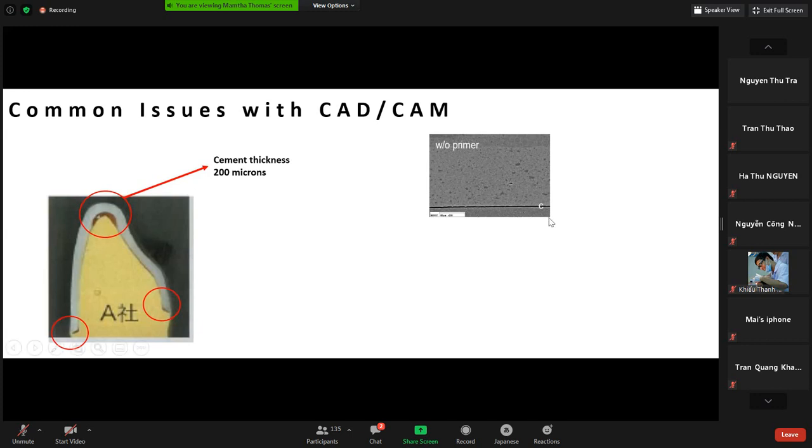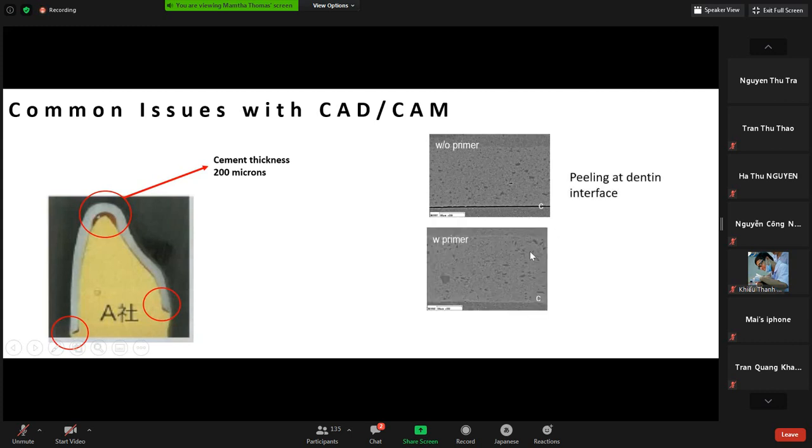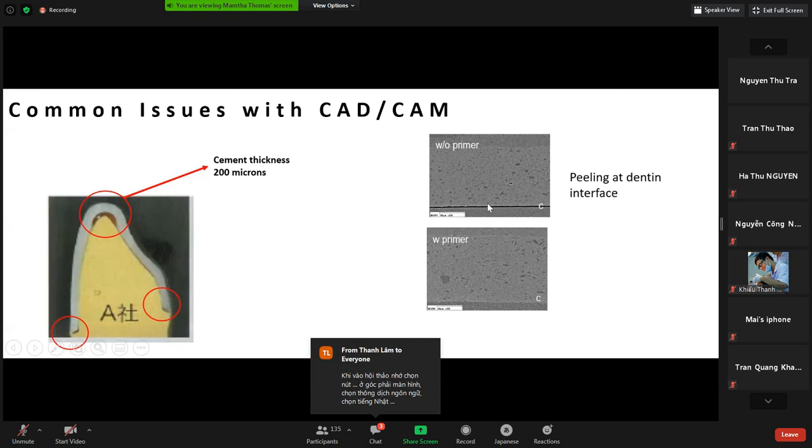So without the primer, we would still see this difference or this black line, that peeling away that is seen. But if we put the primer, that peeling away can be avoided.